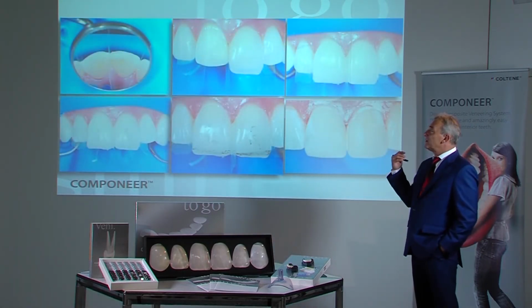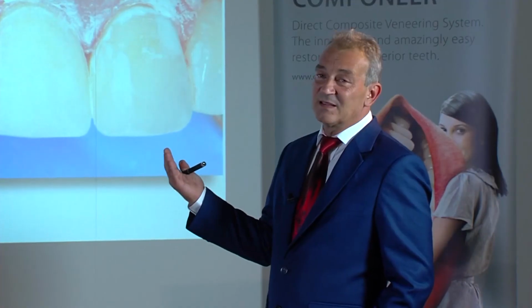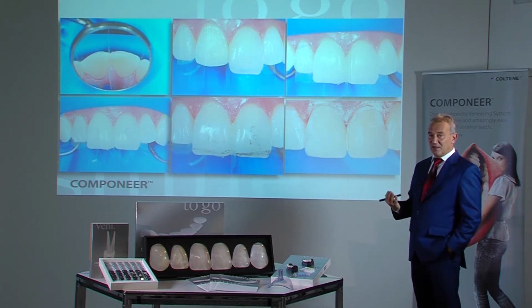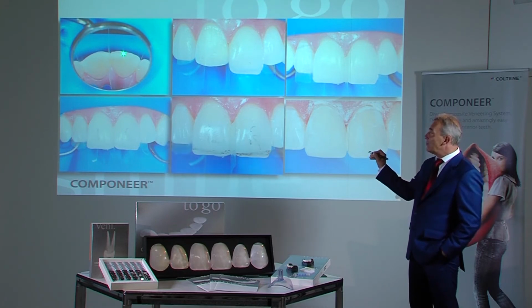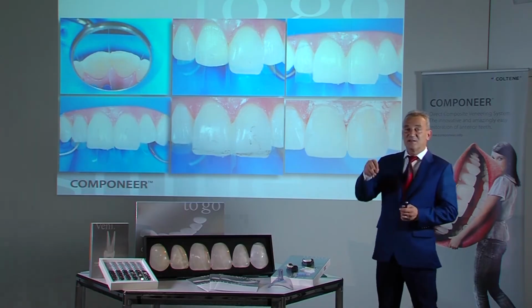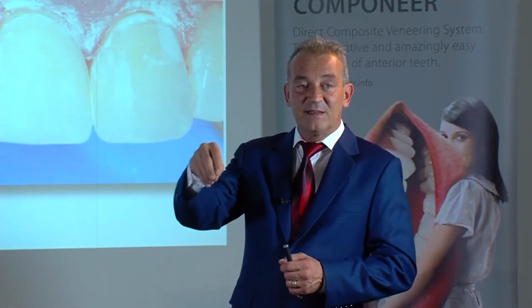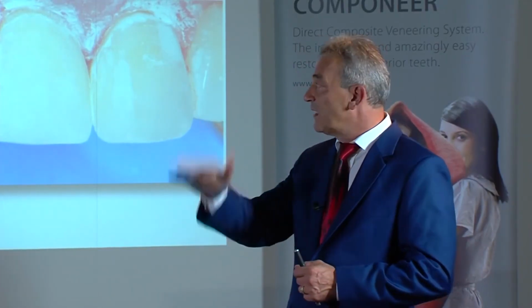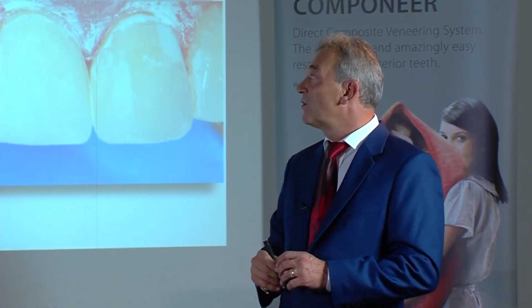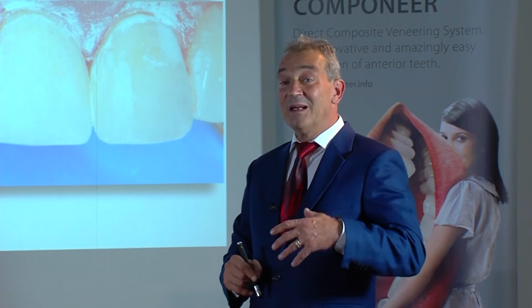In such a case, it is worthwhile taking a brief look at the situation from incisal. Simply use a mirror and check whether there is any interference in the dental arch. When one applies small portions of composite to the surface, small spikes can occasionally be created through movement of the spatula. Such spikes would prevent the Componeer from being pressed onto the surface.